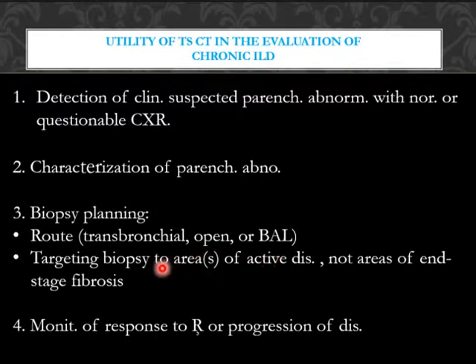When choosing the biopsy route, it can help us to take the biopsy from areas of active disease and not from areas of end-stage fibrosis. Finally, thin section CT can be used for monitoring response to treatment or, in reverse, the progression of the disease.